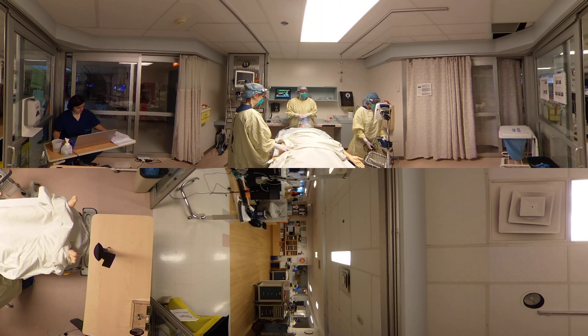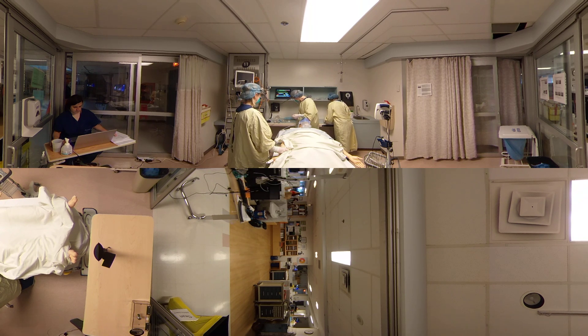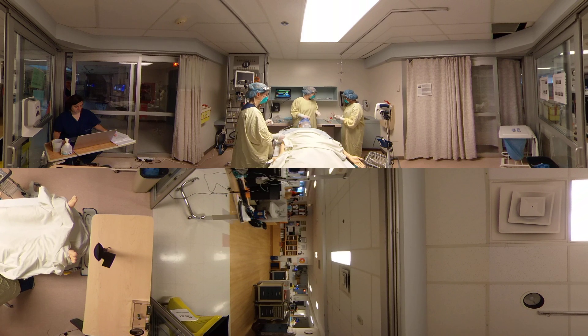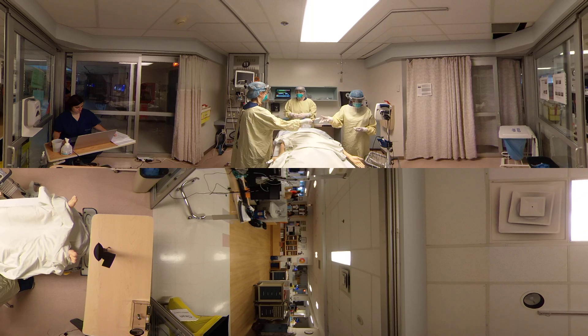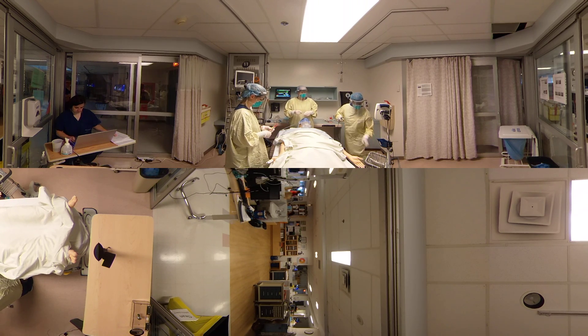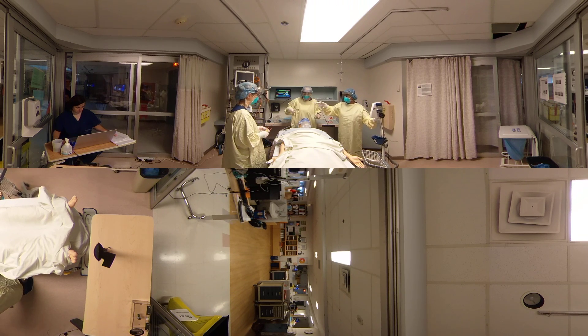I believe we are going to have to do a rapid sequence intubation with cricoid pressure. Stephanie, do you know how to do cricoid pressure? We can anticipate that the patient will desaturate during this procedure. Stephanie, I'm going to give you the intubation drugs — I have ketamine and then I have the rocuronium. I'm going to tell you when to push those. Prahima, can you hand me the glide scope and the tube? Here's the glide scope. And here's the stylet. Thank you.